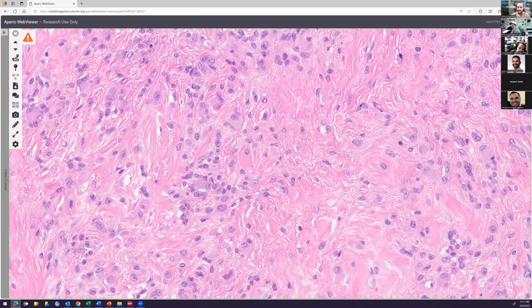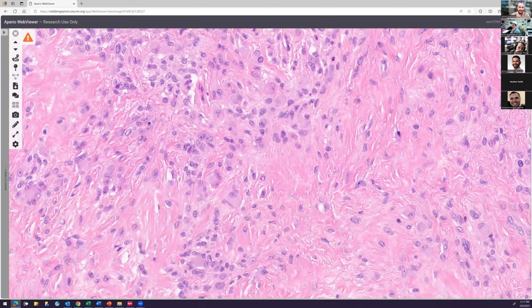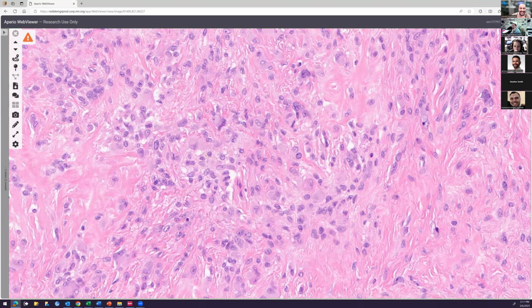Some have very prominent nucleoli too, like a single prominent nucleolus. I agree that there's nucleoli, but I would say it's probably not that prominent. I feel like I'm just shitting on everything you're saying, but they need to be bigger to be prominent, if they are clear and obvious. We love to say prominent nucleoli sometimes, but as a pathology resident you have really good eyes, so you can notice this, but it needs to be prominent to a surgical resident. How about that? That's a gen surg resident.